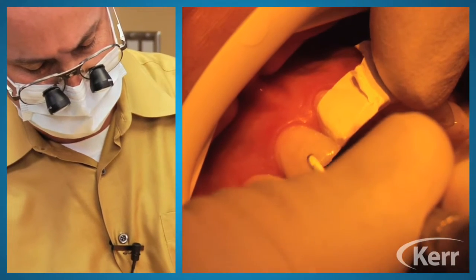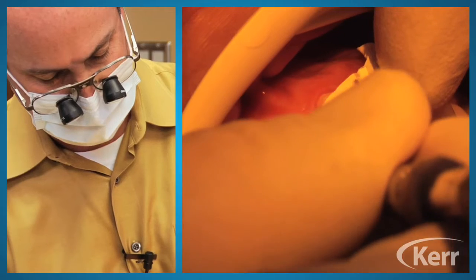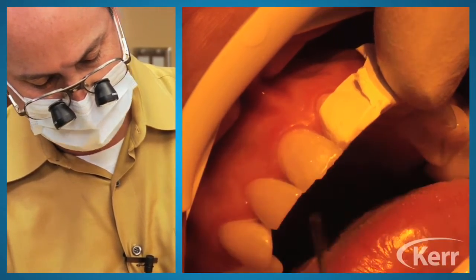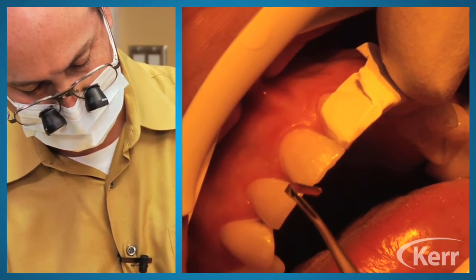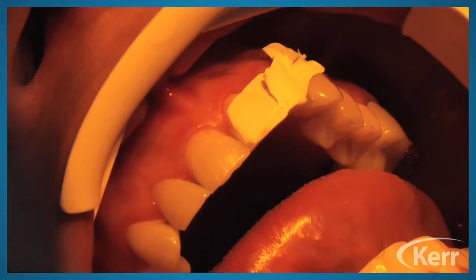So I've extended, you can see hopefully that I have taken it a little bit past the bevel. That's what I like to do with the material, and we will finish it to infinity. So just thin it out, thin it out, thin it out there. All right, I'm going to go ahead.